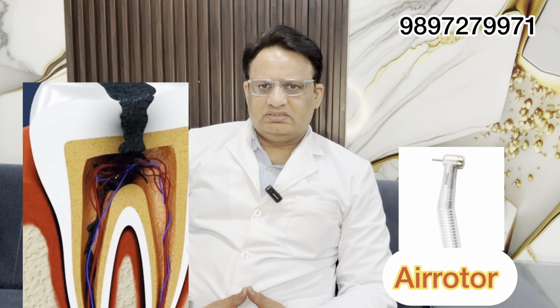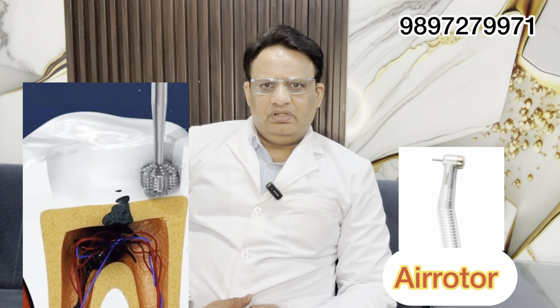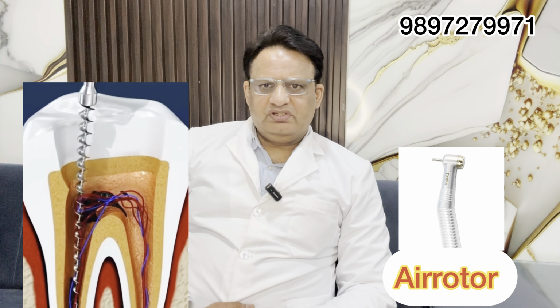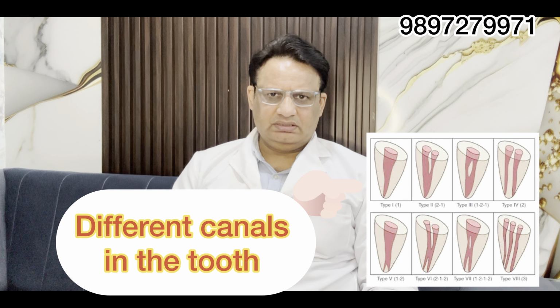First of all, we'll do the access opening with the air rotor, and with the air rotor, we'll reach the pulp chamber. After reaching the pulp chamber, we find the nerve in the tooth. We'll use the hand files to take out the debris and the pulp from the canals. Every tooth has different anatomy. Some teeth have one or two canals, and some have 3 to 4 canals. So we have to find out how many canals there are in the tooth before starting the RCT.